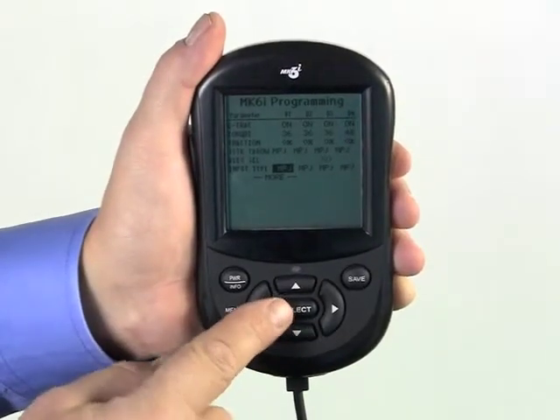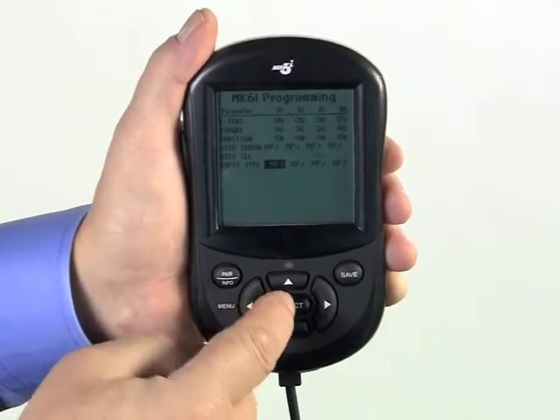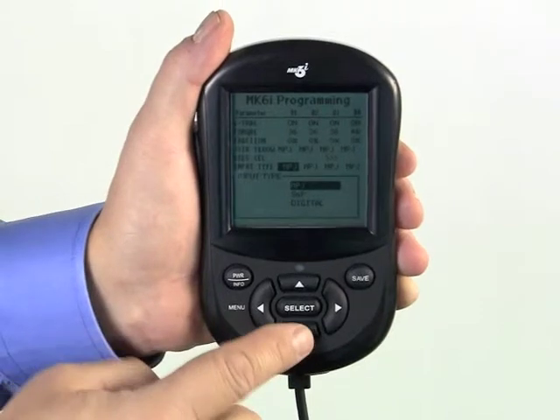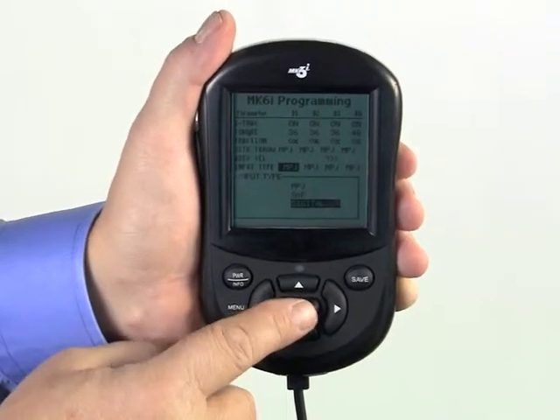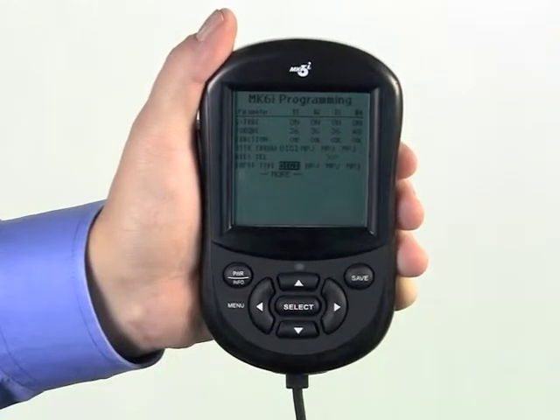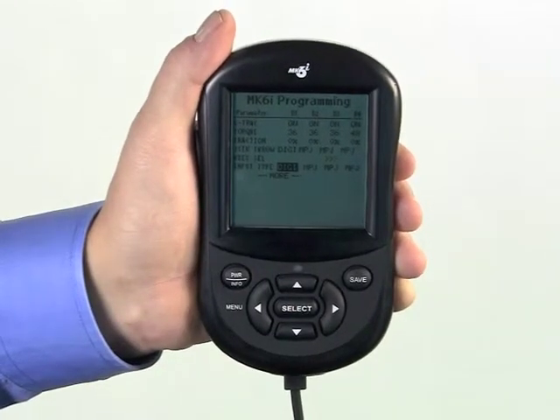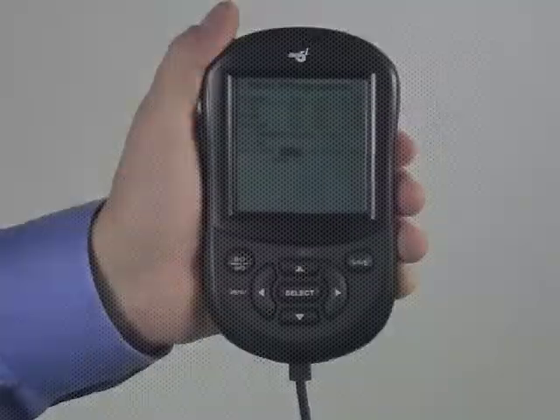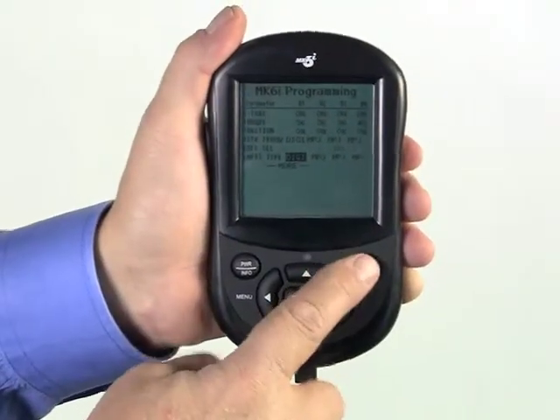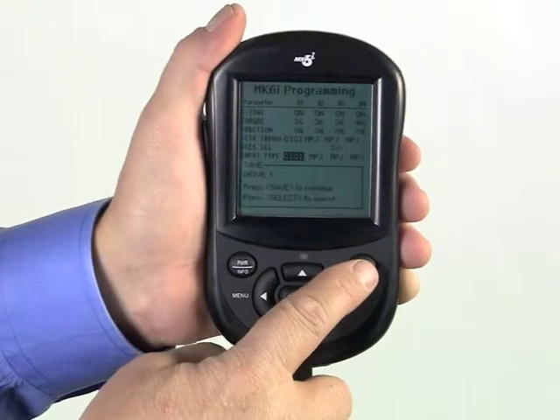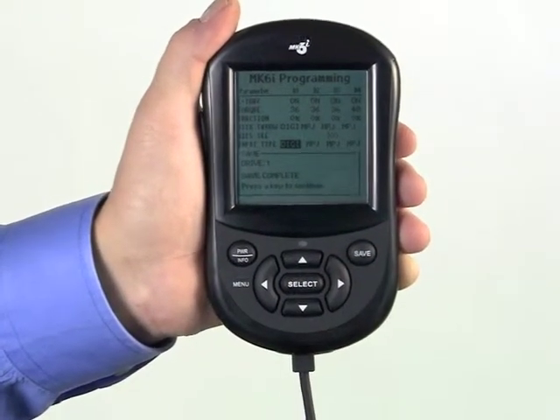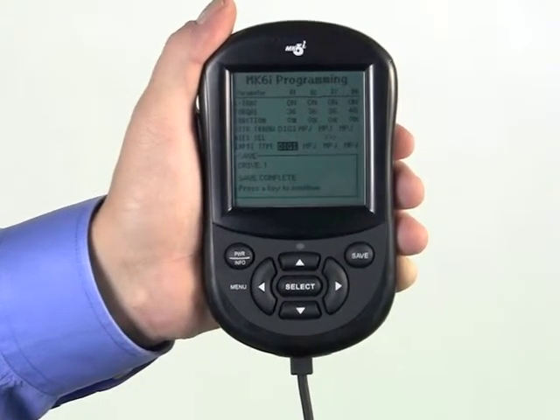The select key displays adjustable values or highlighted choices, and it also verifies choices when selections are made. The save key makes any changes permanent. Saving changes is reviewed in another video along with some helpful shortcuts.